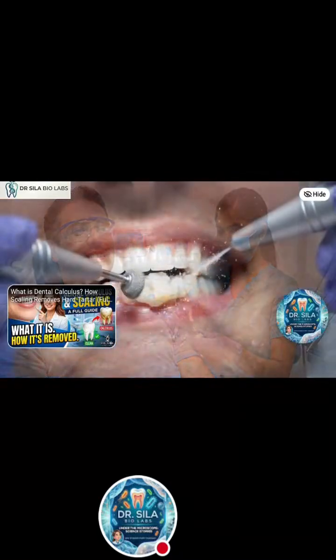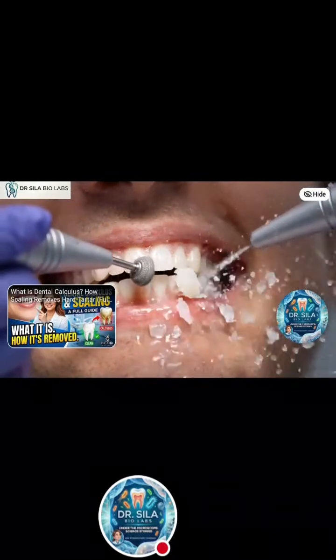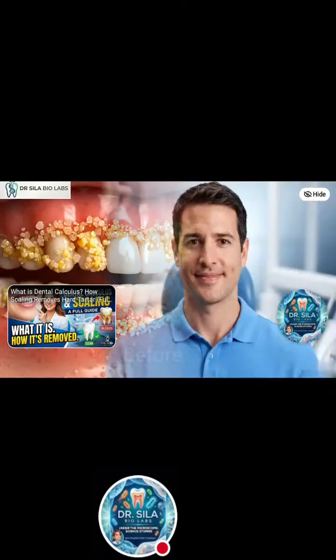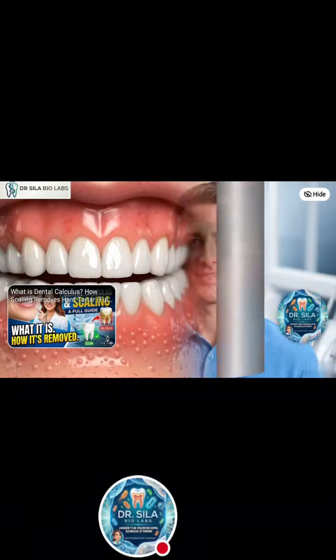Dentists remove calculus through a procedure called scaling. Ultrasonic and hand instruments safely clean deposits above and below the gum line. Regular dental scaling helps prevent gum disease and keeps your smile healthy.